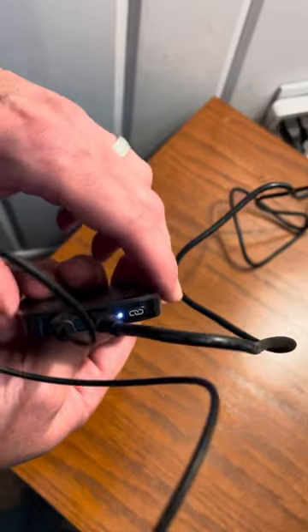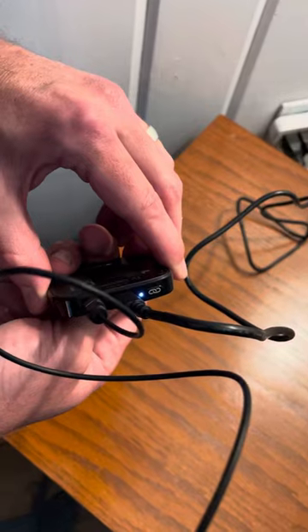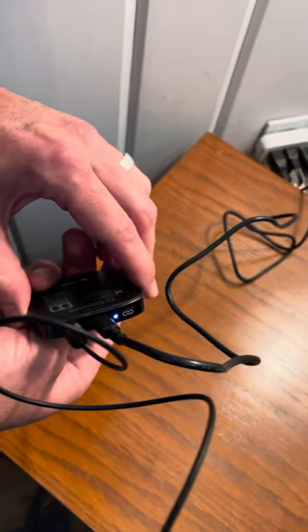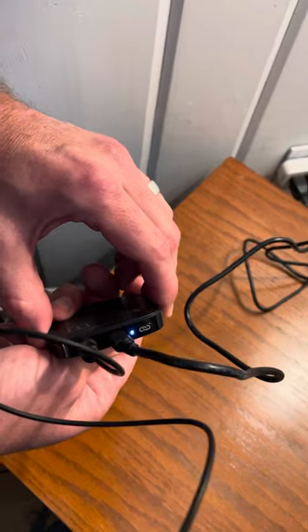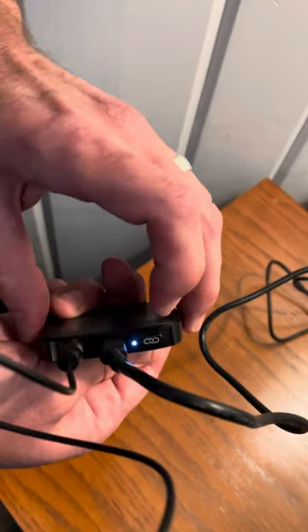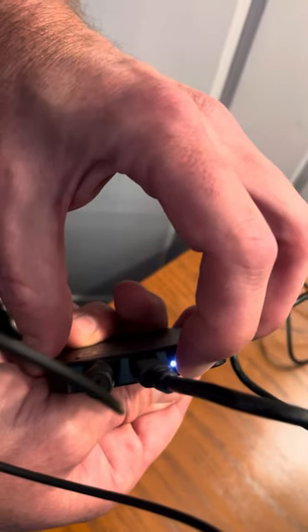What I'm going to show you now is how to reset the connection between your TV connector and your hearing aids — for example, if you are using a set of loaner hearing aids, or maybe you lost your hearing aids and have a new set of replacement aids. To do that, you push and hold this connect button for at least seven seconds.